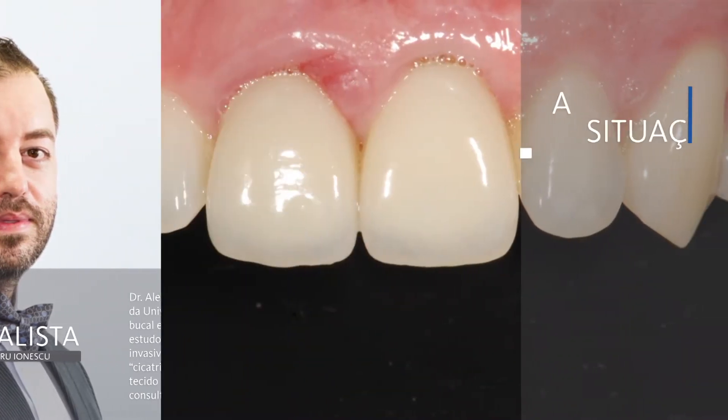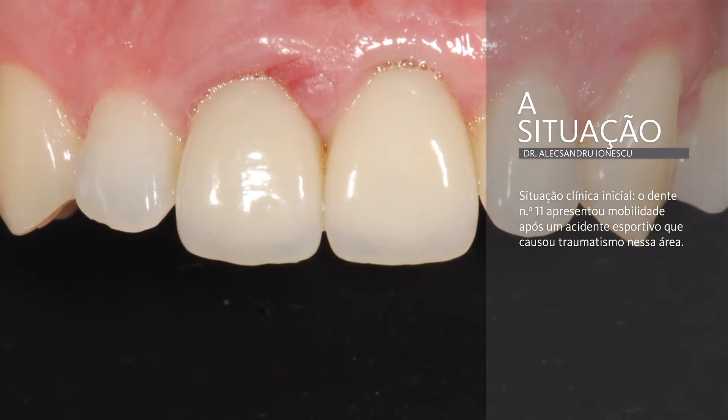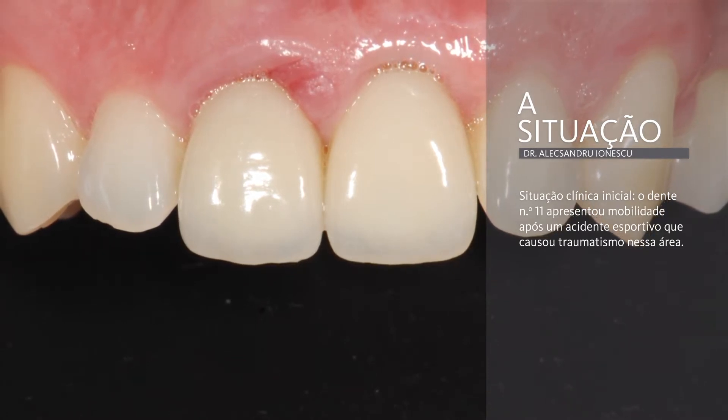In this webinar, I'm going to describe the open healing protocol in post-extraction socket and the advantages of choosing Geistlich Bioguide as the golden standard for this technique.